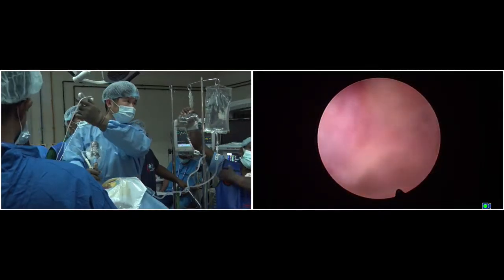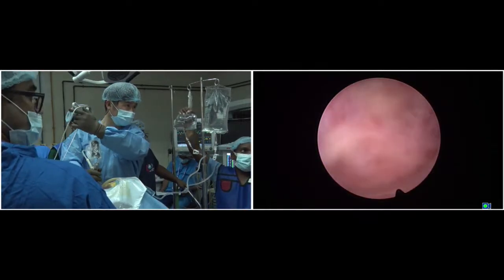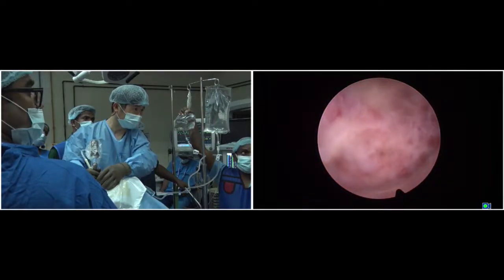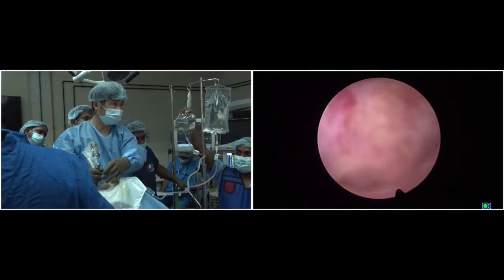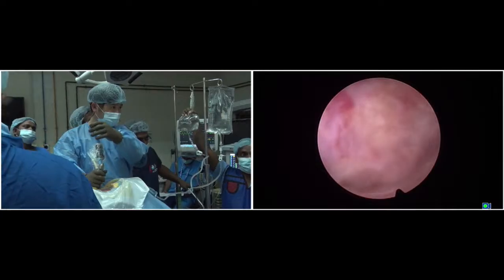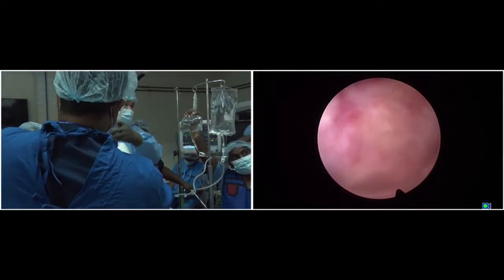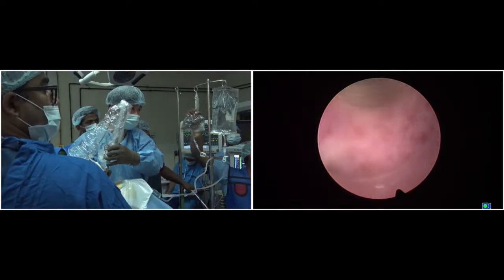Okay. Three. No, there is some problem. Three. I see, here is a pedicle. Okay. The instrument is not full. There is a problem. Don't worry. Maybe.